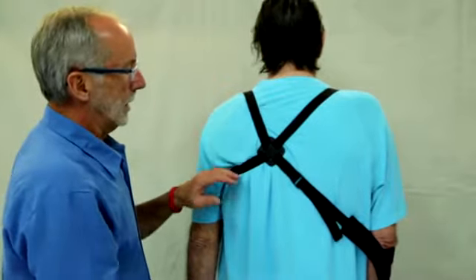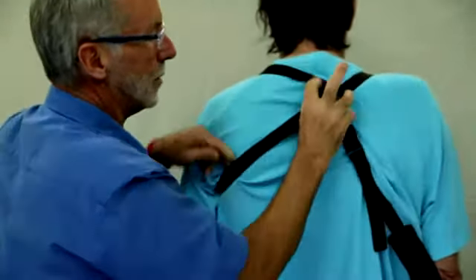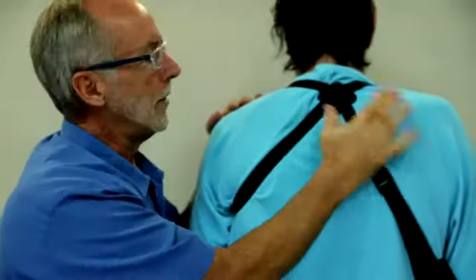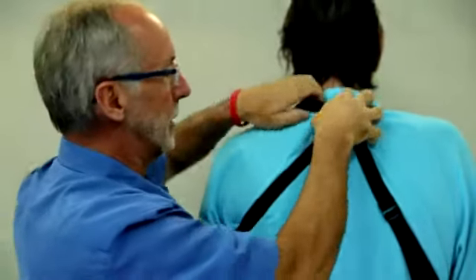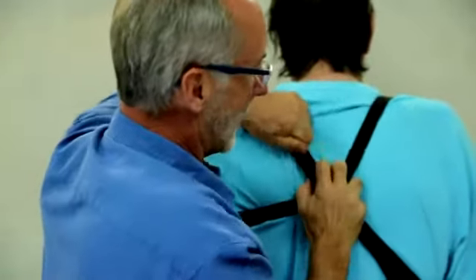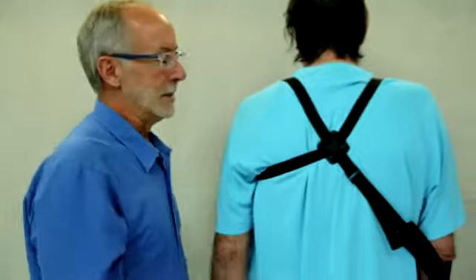The important thing is you almost never want to have this up on the base of the neck. Then we've got weight-bearing on the base of the neck — the arm is being supported by the base of the neck — and that's something we don't want. Just know that you can slide this around wherever you'd like it to be, and then lock it in place.